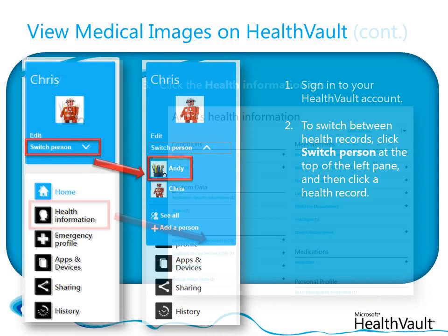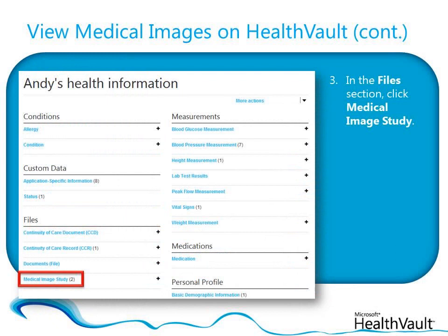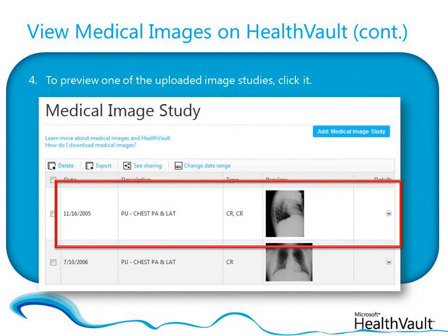Next, click the Health Information tab, which is the main point of access for all the information in the health record. In the Files section, click Medical Image Study to see all of the medical image studies uploaded to this health record in a preview list. To view one of the uploaded image studies, click its entry in the list. Medical images that have been uploaded to your HealthVault account can be managed and shared just like any other health information in your account.